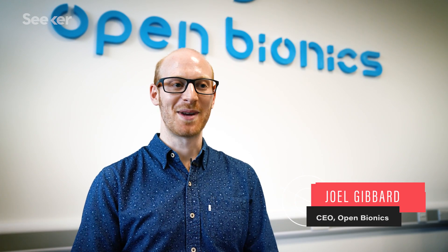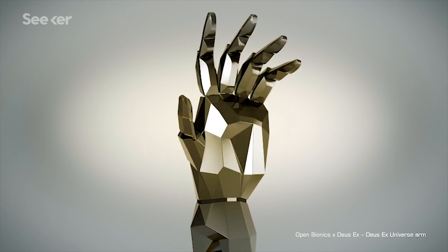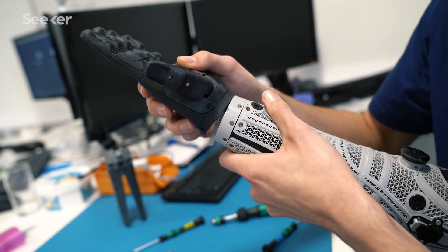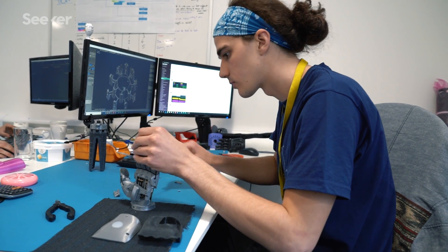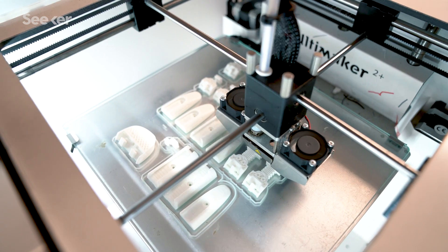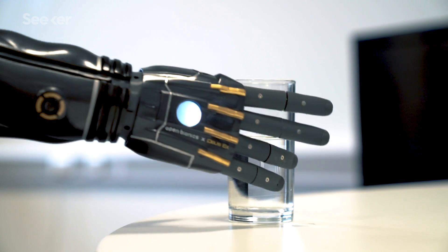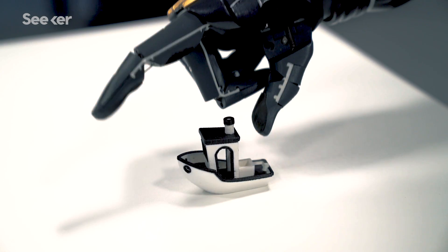Open Bionics is a Bristol-based startup and our mission is to create and democratize technology that enhances the human body — in other words, we turn disabilities into superpowers. The Hero Arm is our first bionic product; it's the first medically certified 3D printed bionic hand and also the most affordable bionic hand available. It's a multi-grip hand with four motors inside controlling individual fingers and moving the thumb.